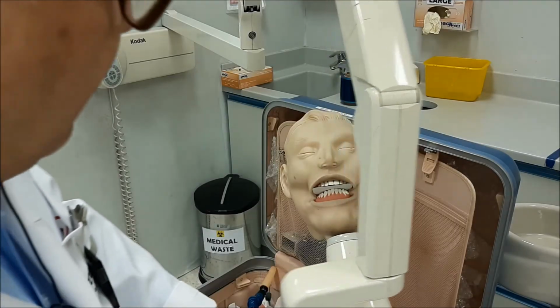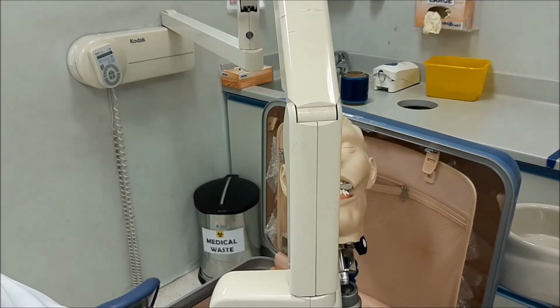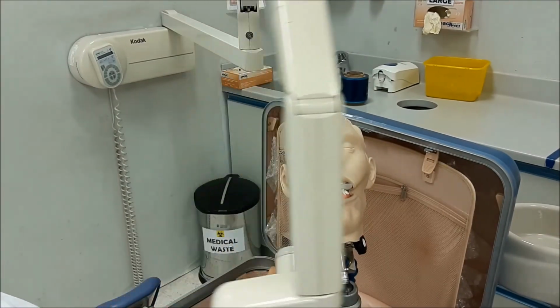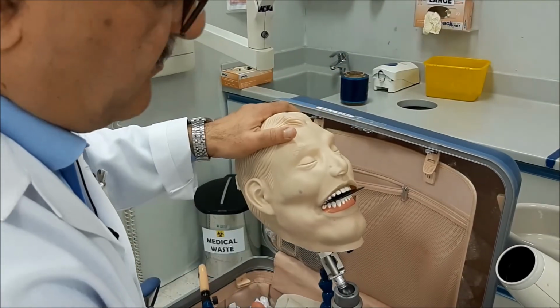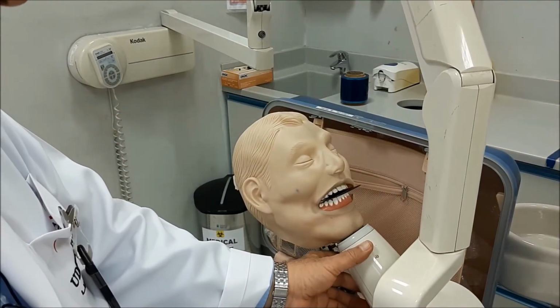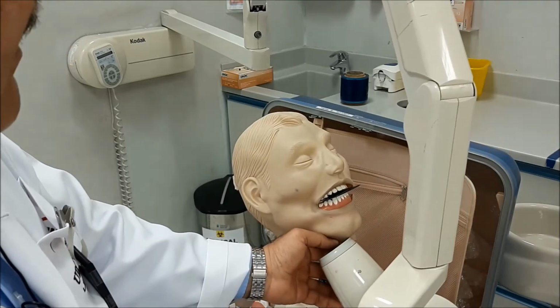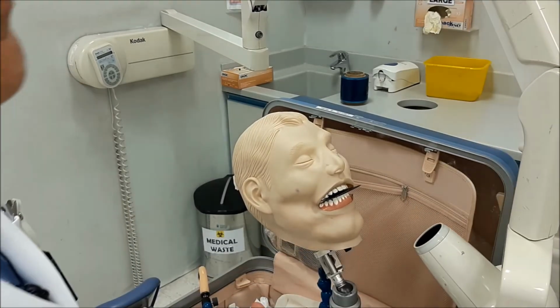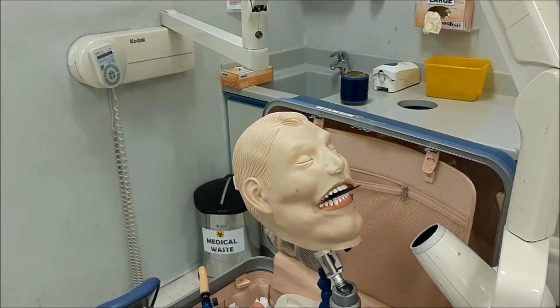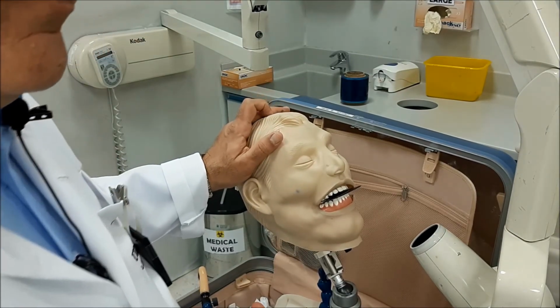Okay, if you direct it to either side, this side or this side, let me show it to you from the other view. See, it goes along the mid-sagittal plane. If you direct it to either side, you will not have complete coverage of the area. Okay, so you better direct it with the midline or the mid-sagittal plane of the patient.